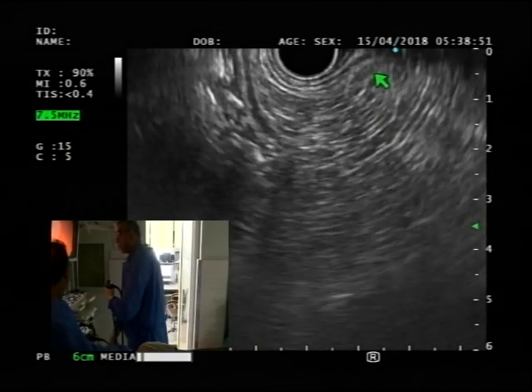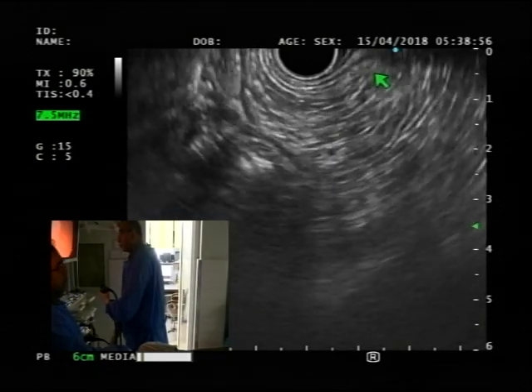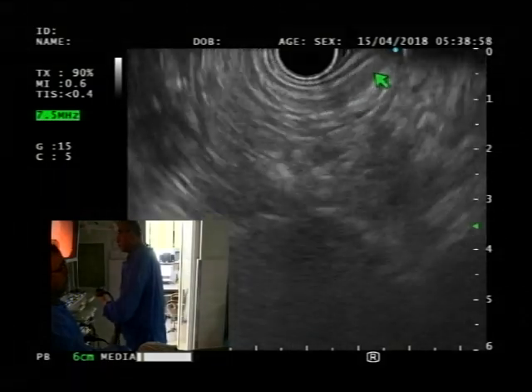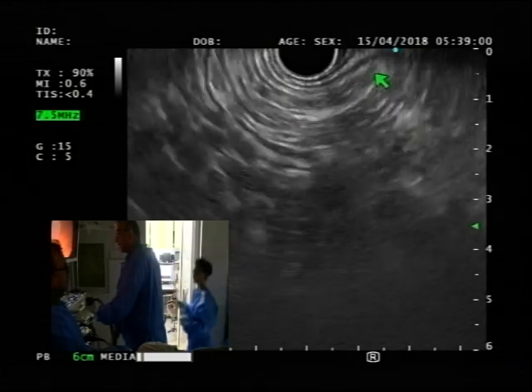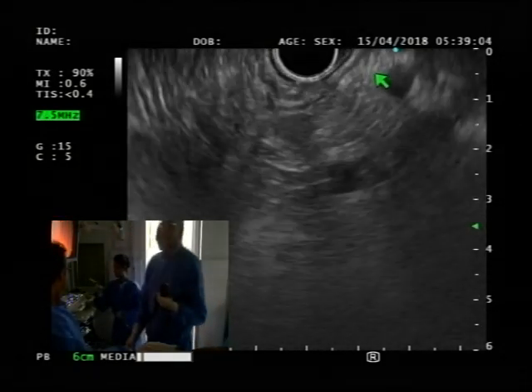Done, that's it. I'd like to move on. Yeah, we should be fine. Okay, I think we have enough. How about we do mediastinum? And then we can get this wrapped up.